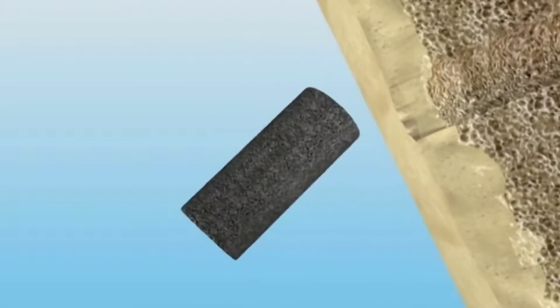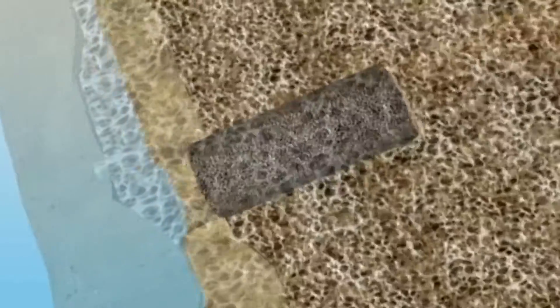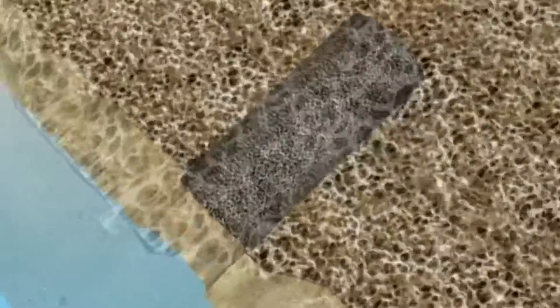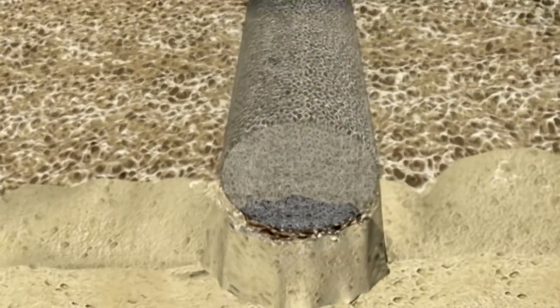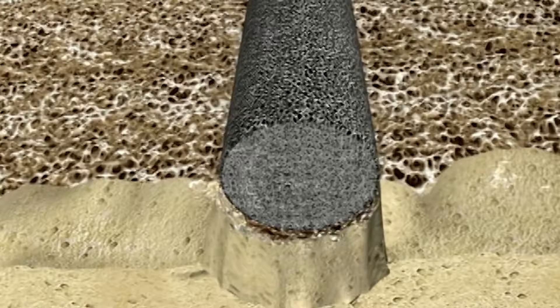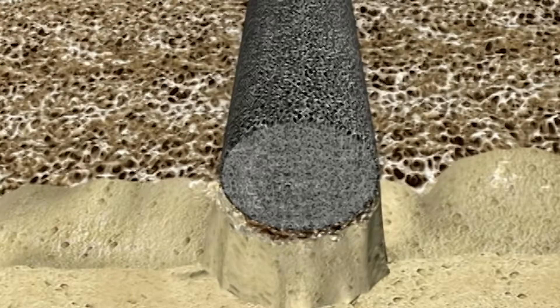Consisting of elemental tantalum, trabecular metal material is fabricated by means of a vapor deposition technique that creates a metallic strut configuration much like that of trabecular bone.